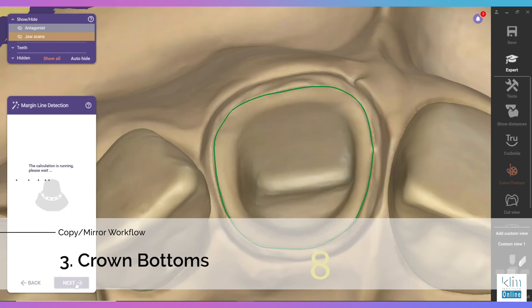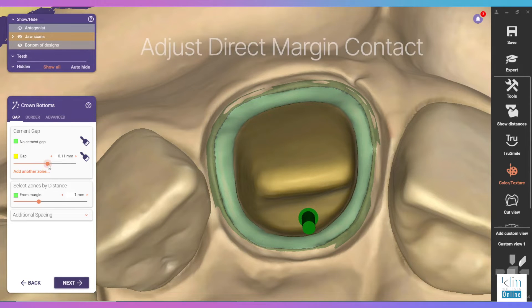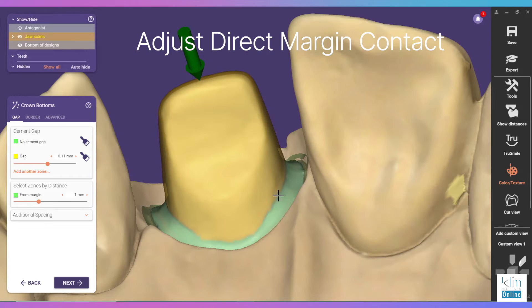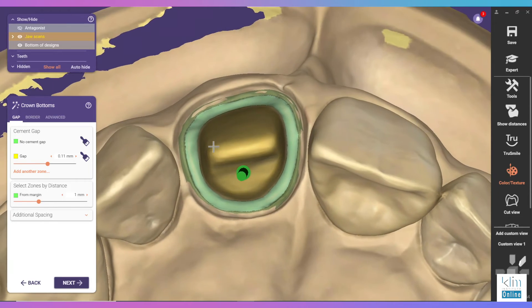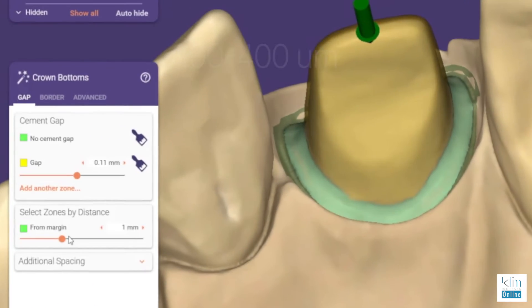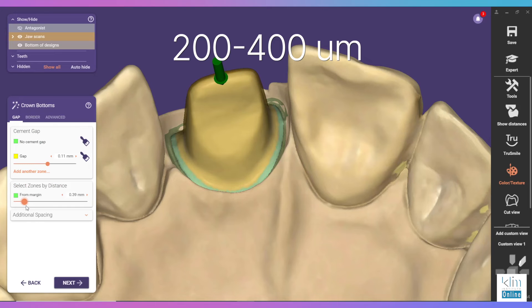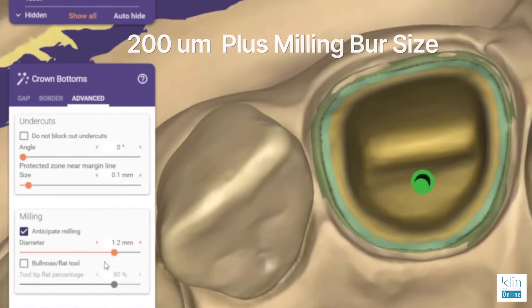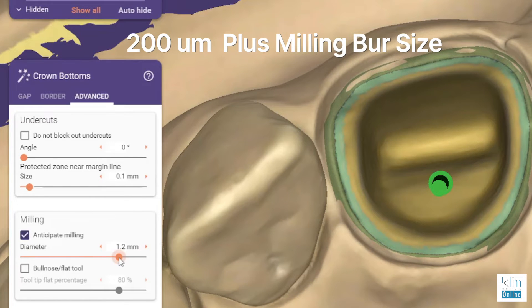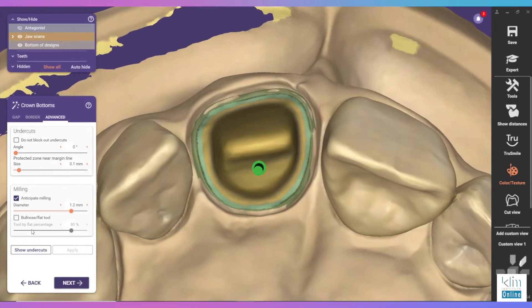The next step is crown bottoms. There are two things I want to look at — particularly the intimate contact of the ceramic or material on that margin. We don't want that green line to be going up the axial wall as that could create binding. You need to know your milling unit, but in most cases 200 to 400 microns for that intimate marginal thickness area will be adequate. Go to the advanced tab, know your burr size for your milling unit, and add 200 microns to that size — that's important to check, otherwise it could knock the restoration off the block during mill.